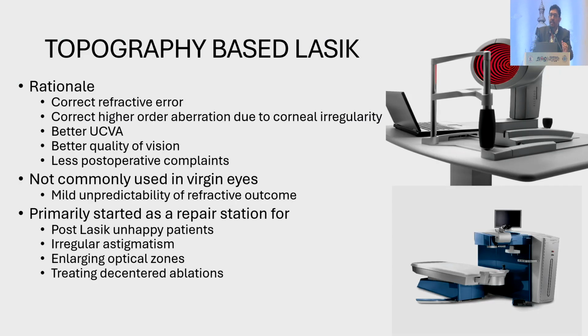And this was the reason that when it was initially launched, it was primarily meant to be a repair station where you could treat unhappy patients, you could treat irregular astigmatism, you could treat them to enlarge the optical zone, you could treat decentered ablations as such. It's only recently that there's been a lot more interest in treating virgin eyes because we've started understanding what treating these additional higher order aberrations on the surface does to the refractive outcome, and then we try to tweak our manifest refraction to end up getting a better result.